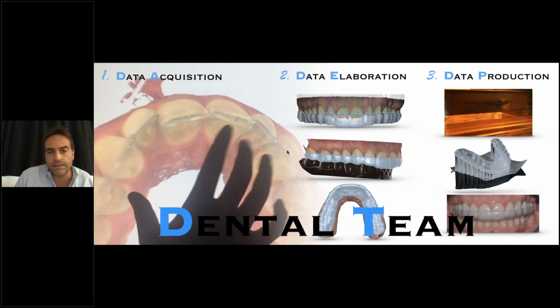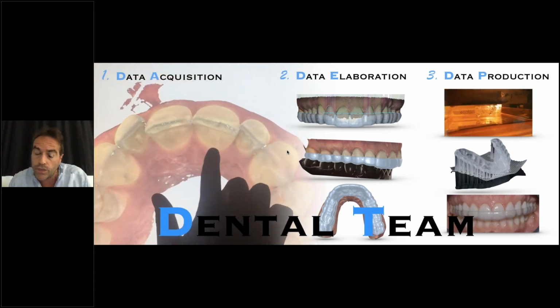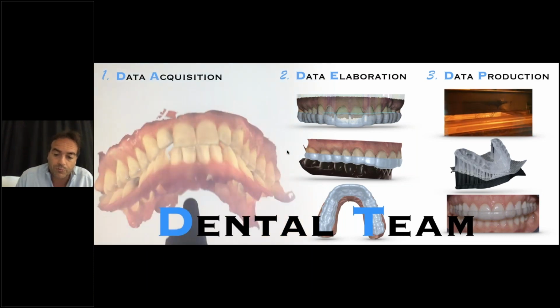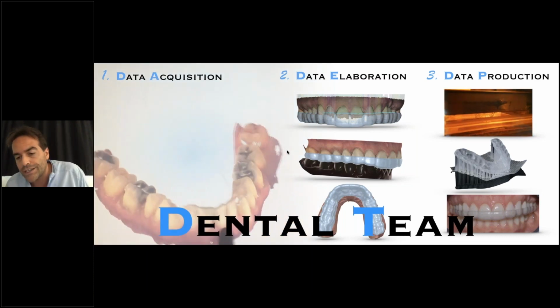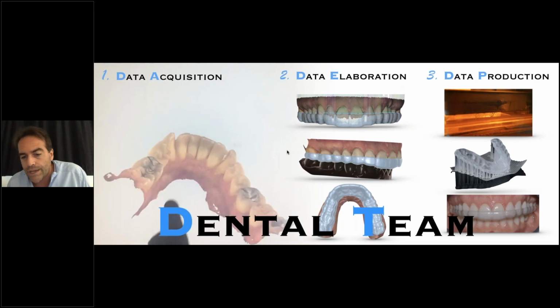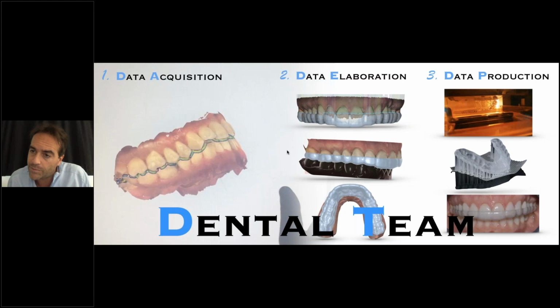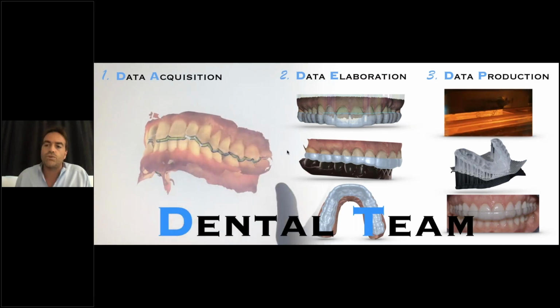So you see that data acquisition, data elaboration, and data production, which is another great topic today, because data production more and more is done through the help of 3D printers, and so 3D printers are just another piece of the puzzle that we always need to consider.